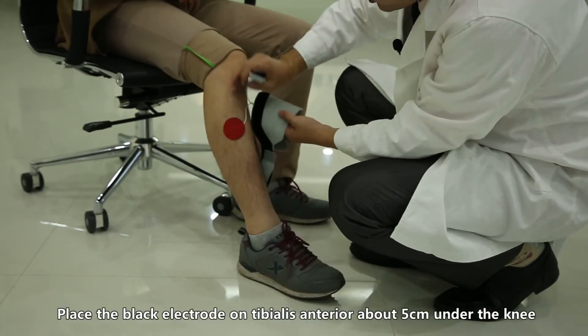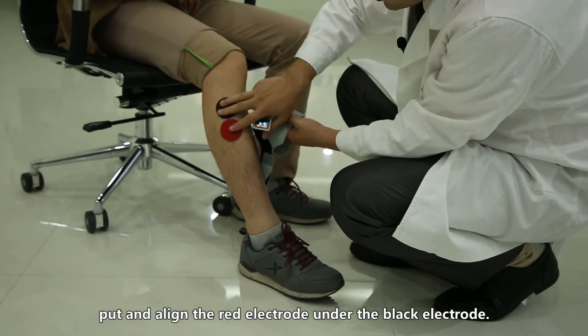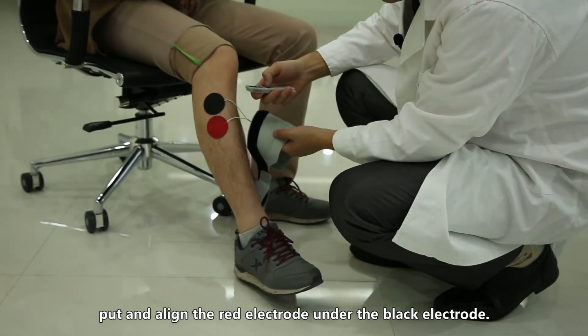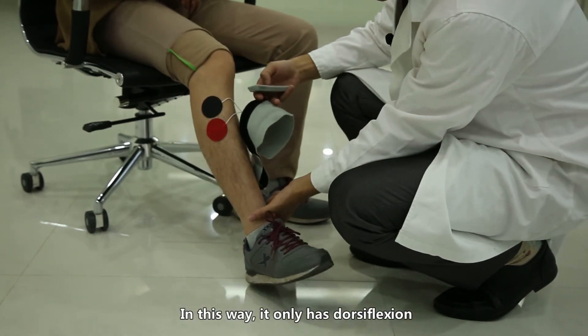Place the black electrode on the tibialis anterior about 5 centimeters under the knee, and align the red electrode directly under the black electrode. In this way, it produces dorsiflexion only.